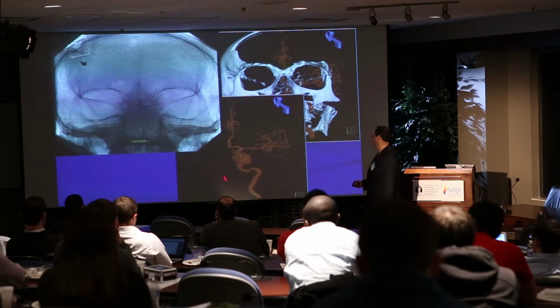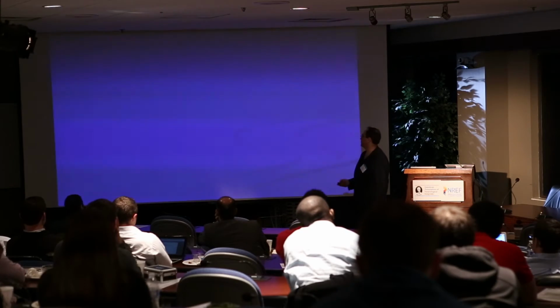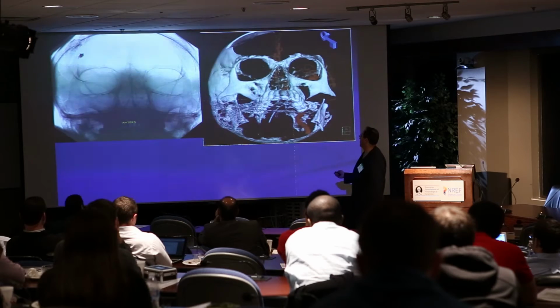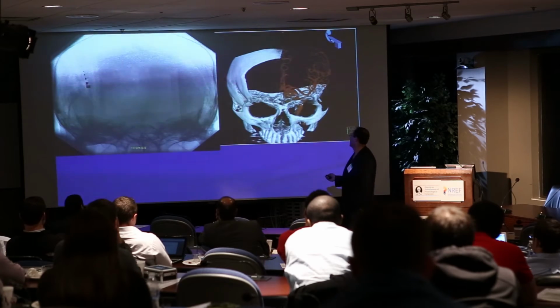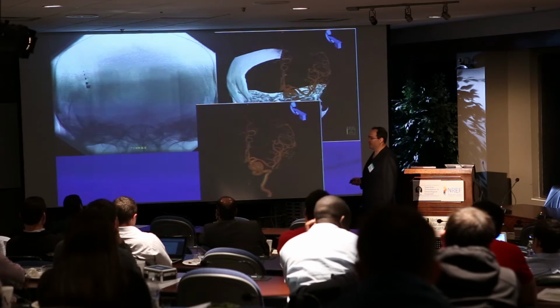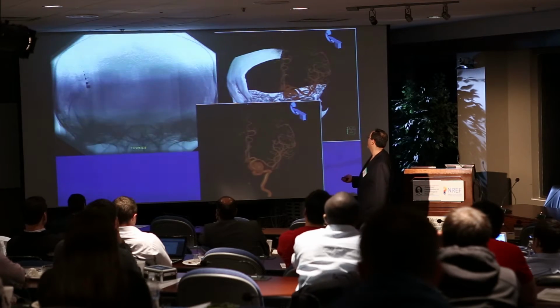And again, it helps you open up the pathology a little bit and open up the MCA. The Waters view, we're all familiar with. And lastly, Towns. Here you have an anterior circulation, but usually Towns, traditionally, we're trying to open up the basilar tip.